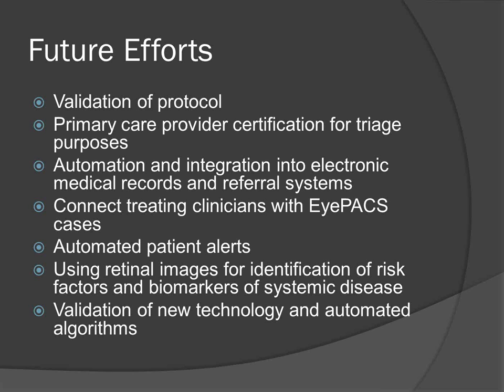We're pretty excited about some new developments in EyePACS that would allow your clinics to be able to automatically contact patients if there's an urgent referral that's needed, or if they're due for imaging once again, maybe via a text message to their mobile phone, things like that. I think with most people having mobile phones, that's a possibility. We know that it's not possible in all community clinics because of the reliability of the phone numbers that you get, but it may be something that's useful for some of the clinics.